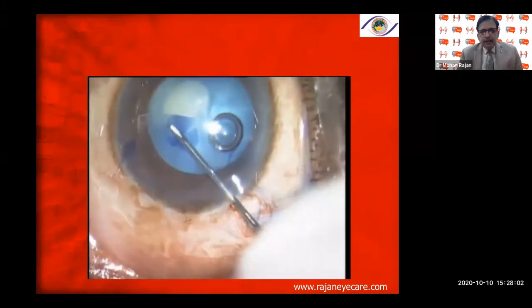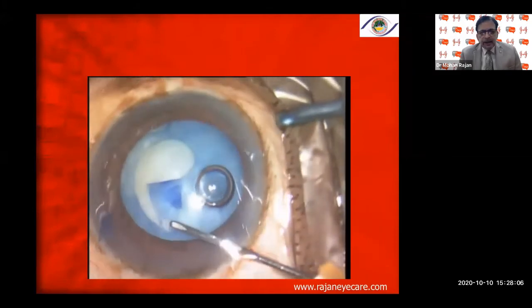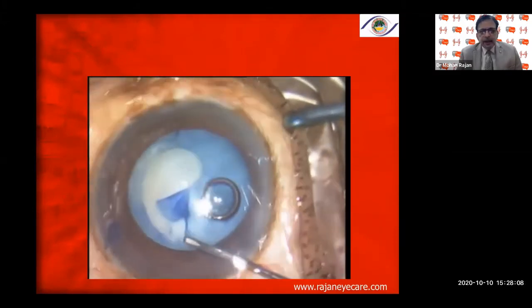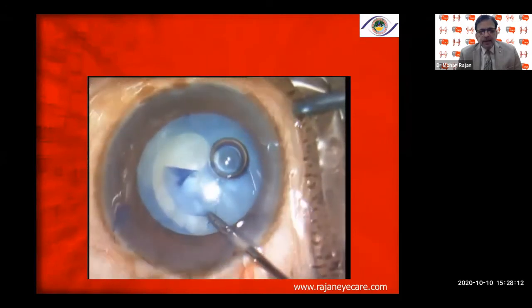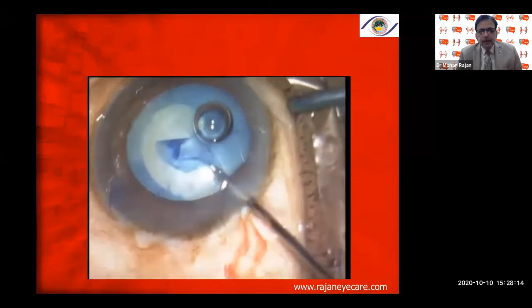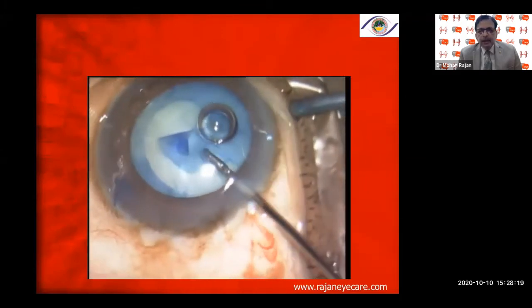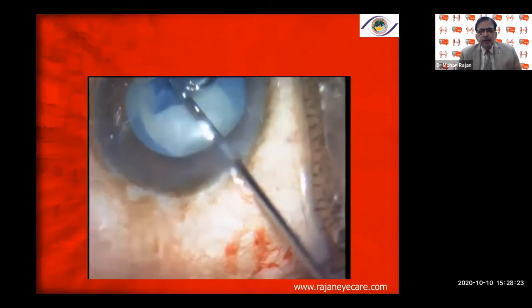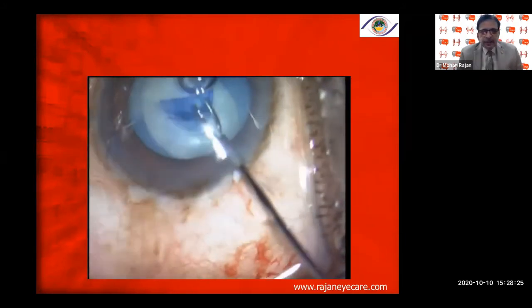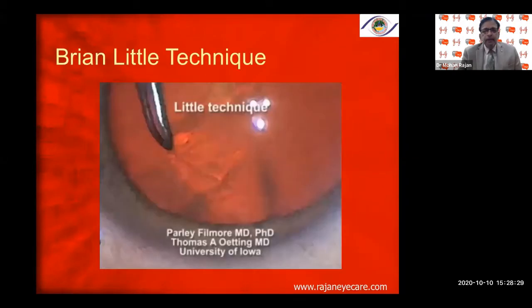Here in another patient with a hypermature intumescent cataract, the rhexis is starting to extend — I inject viscoelastic and use a micro capsular rhexis forceps, trying to catch the base of the capsular rhexis and pull it towards the center to retrieve the capsular rhexis without extending it into the periphery.